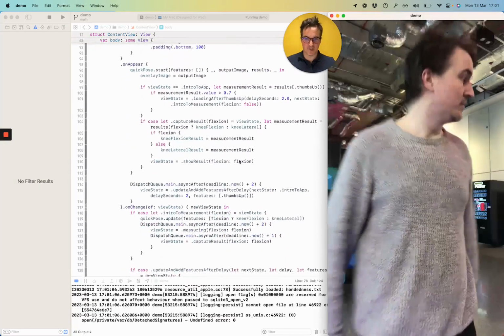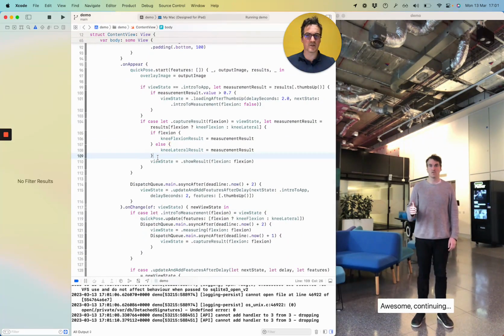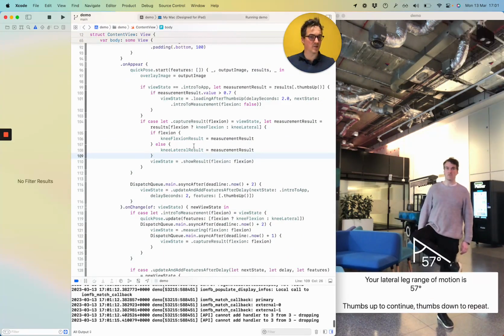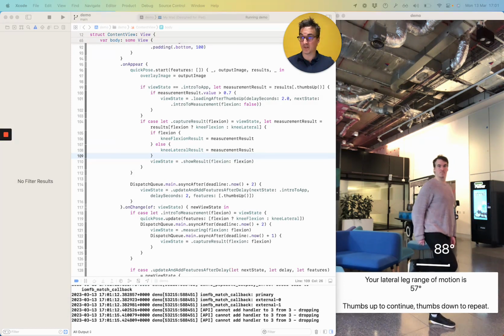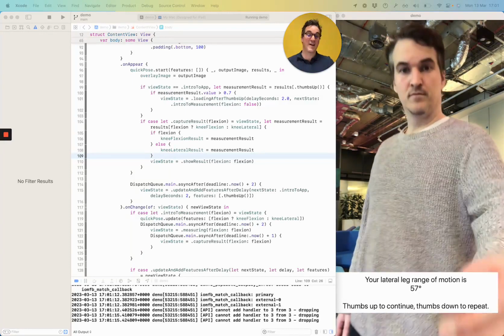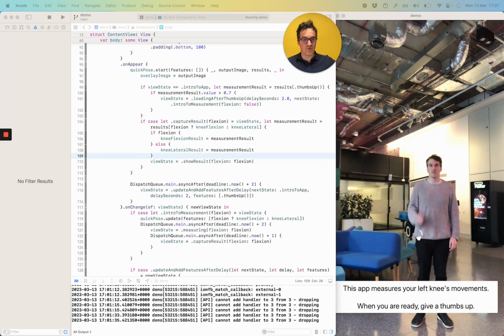So this is all starting to come together. I still don't see where we're launching to the second stage yet. So after this, we get that results screen. Great. But there isn't that logic, the thumbs up to continue, thumbs down to repeat. We've not done that. We're very close to finishing, however, so let's just put that feature in, and then we might be able to release this. Almost. I mean, jokes aside, it's almost there.